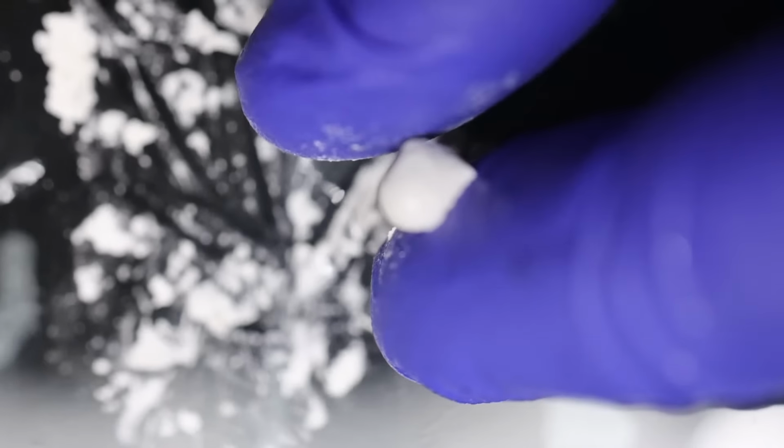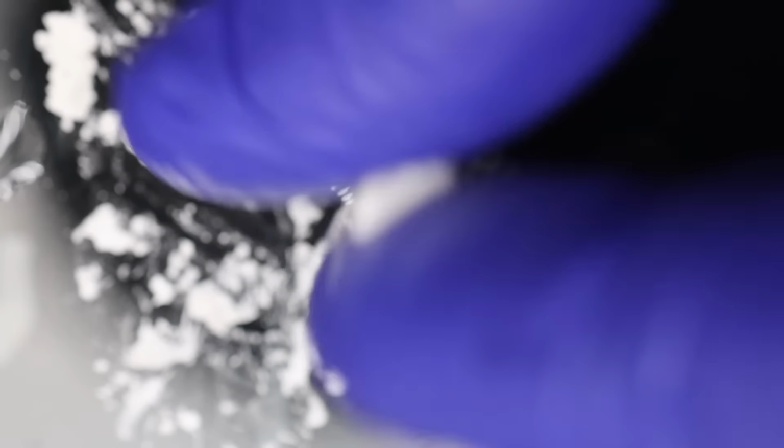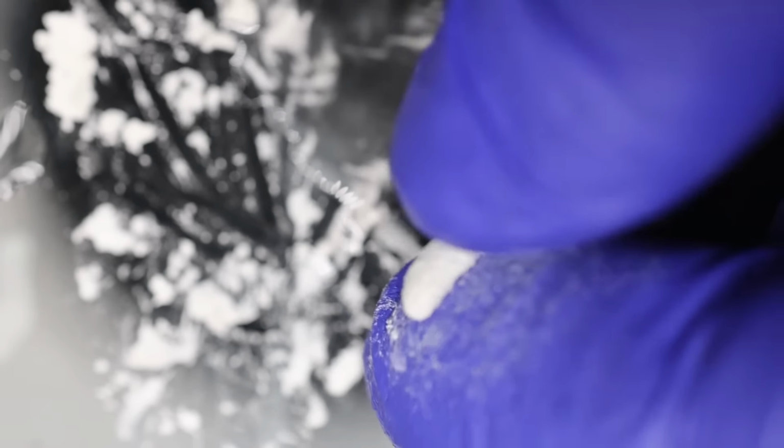So when we see this, this is the consistency that we want, which is moldable, that we can roll in any condition. Okay, so this is what we will be using in our restoration part. Now we can just take it with the help of our instrument.